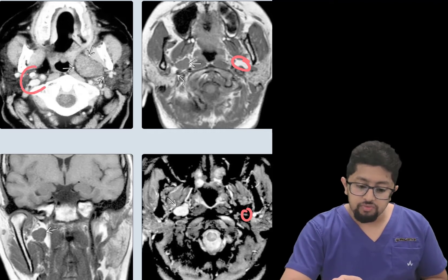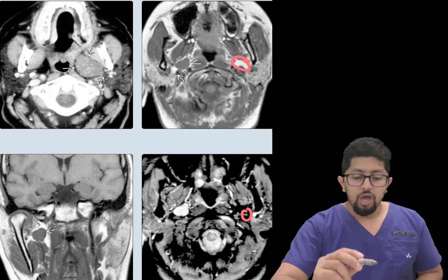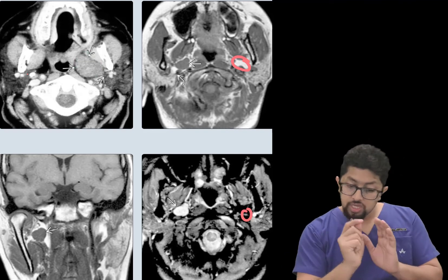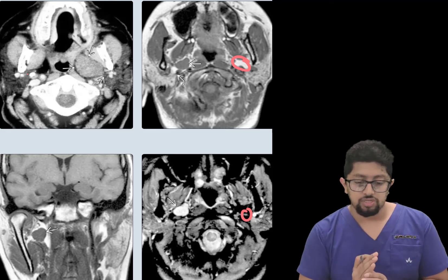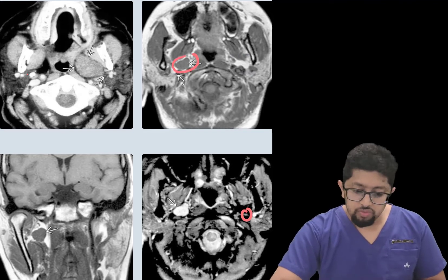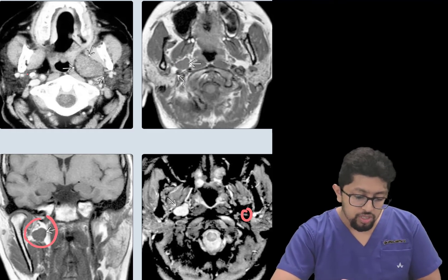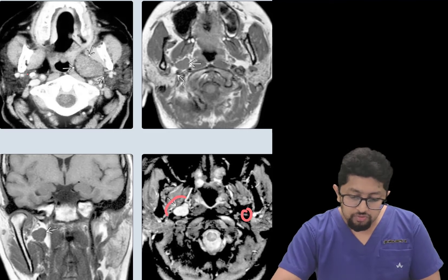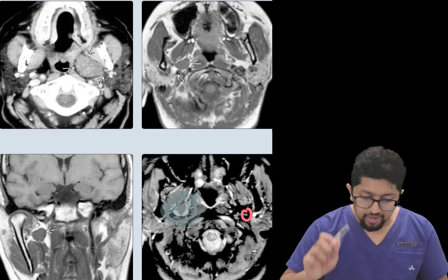This is a contrast-enhanced CT — we can confirm this because the blood vessels are appearing hyperdense. There is heterogeneous enhancement of this lesion, which is one of its key features. On T1-weighted MRI, the fat is surrounding the lesion, and it is a well-defined lesion, which is very important. The coronal section of the same image also shows this well-defined lesion surrounded by fat.